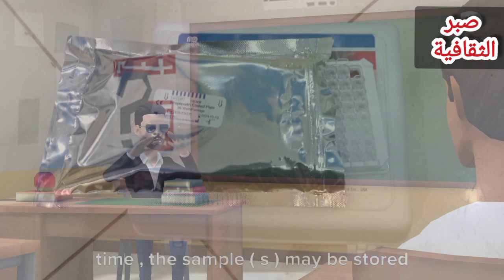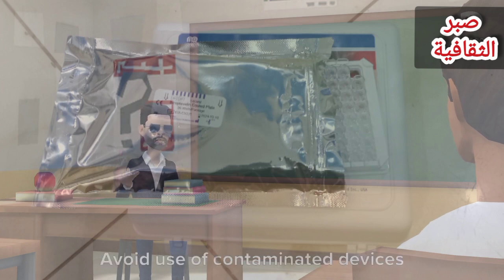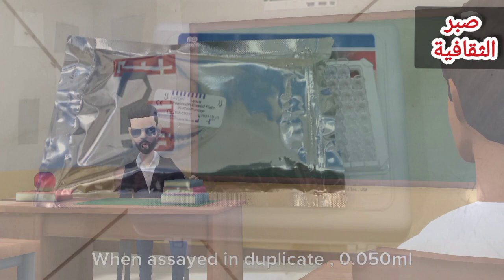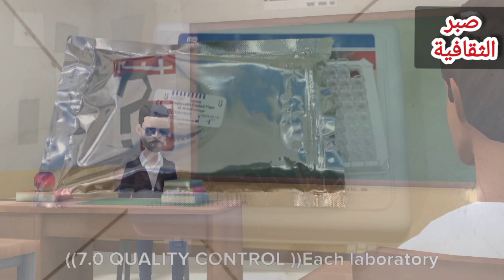The samples may be stored at temperatures of -20 degrees C for up to 30 days. Avoid use of contaminated devices. Avoid repetitive freezing and thawing. When assayed in duplicate, 0.050 milliliters, 50 microliters of the specimen is required.